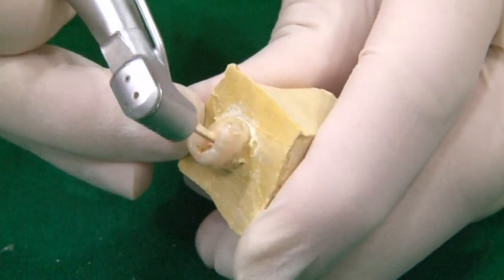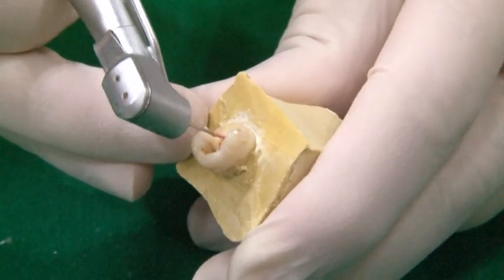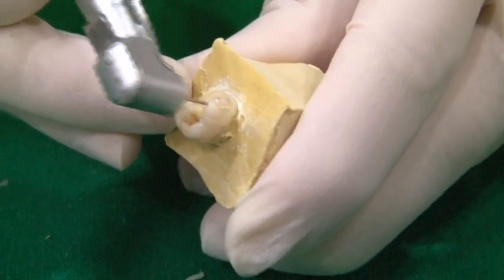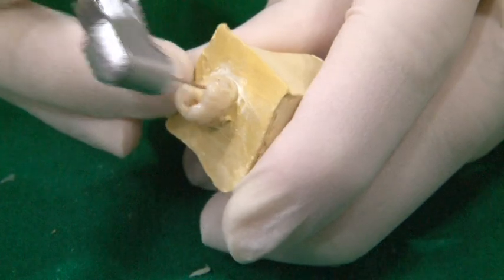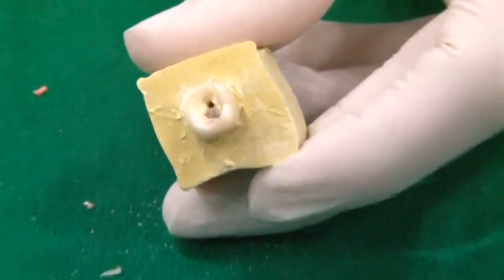With this reamer, we will prepare the basic length of the post space. Ensuring the GP is completely removed from the canal, we will enlarge the post space using No. 2 and No. 3 Peeso reamer.